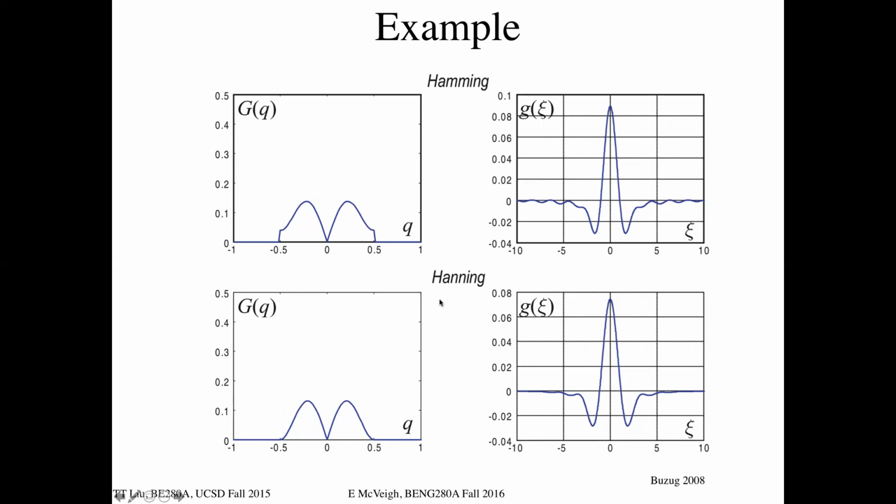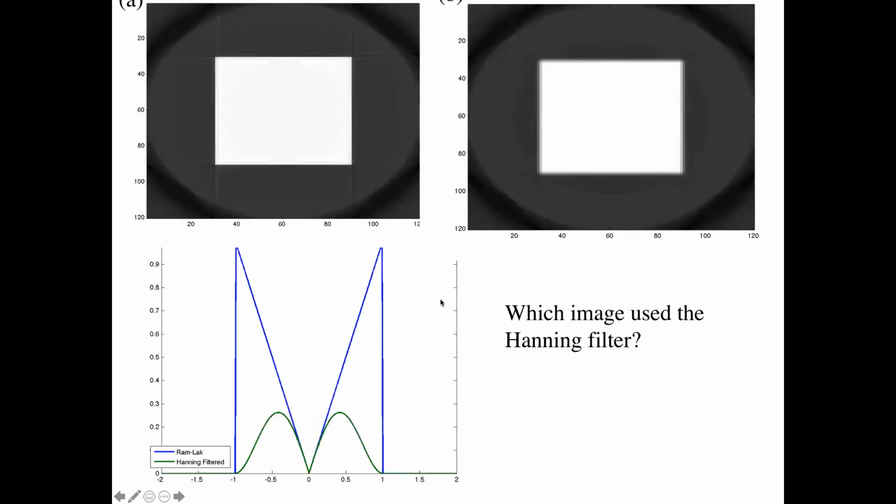Okay? And so all of these filters are available on a scanner. They usually have different buttons. And if you press the bone filter, right, it usually is this, which is just the ramp filter. And you will get very high resolution pictures with high frequency components in them, but the noise will be pretty high, just the random noise in the picture.